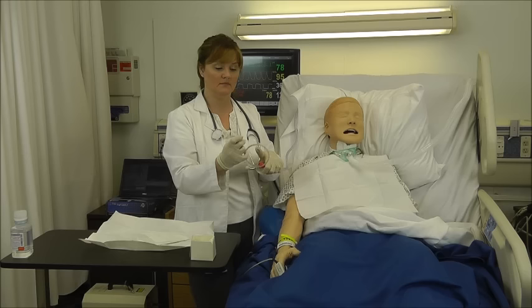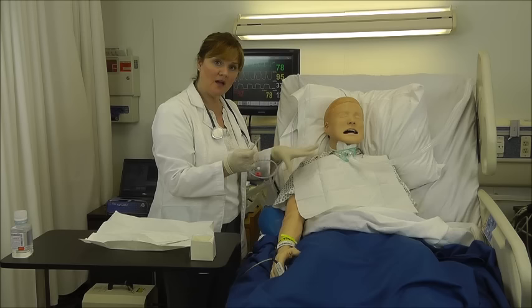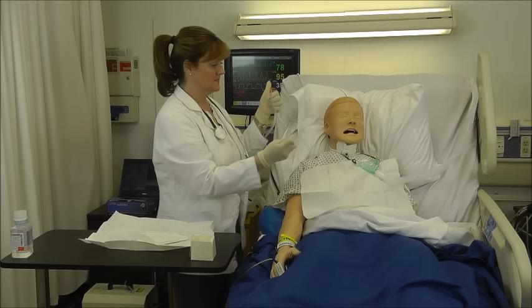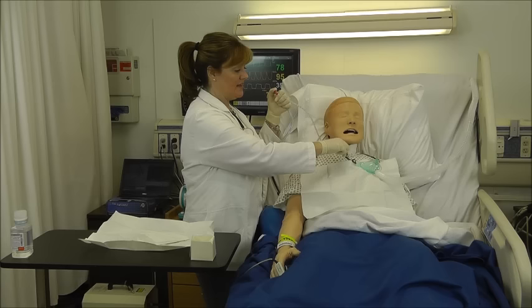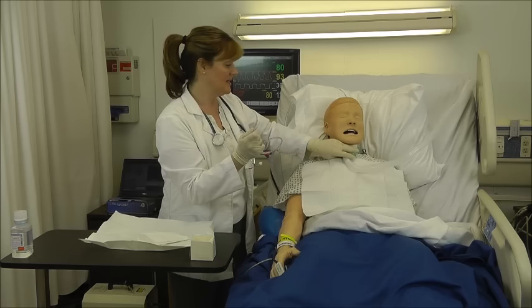It's been 30 seconds, and you can still hear some secretions moving in that upper airway. And I ask the client, does it feel as though I need to go down again? And he shakes his head yes, so I'll go again. My thumb is off the suction. I advance, keeping my hand sterile, to the 20. I twist as it comes out, walking my hand down the catheter, and I apply suction intermittently. Hook this. Give him his humidified oxygen back. Noting the secretions, then I'll clear the line.